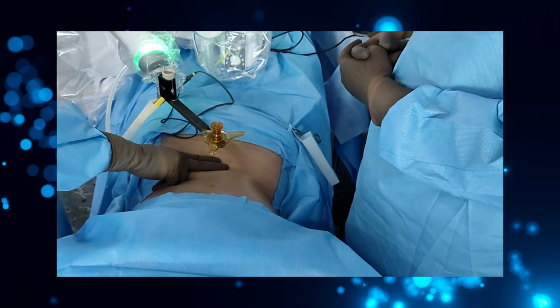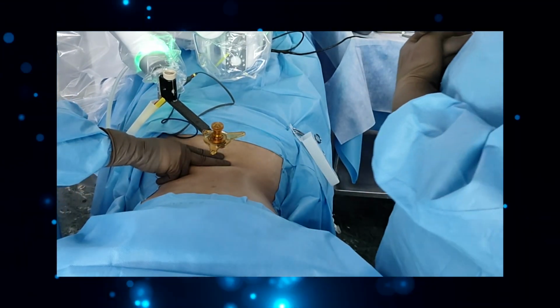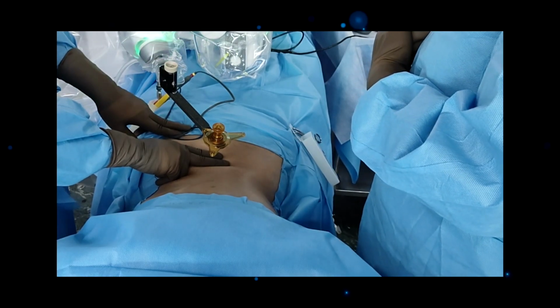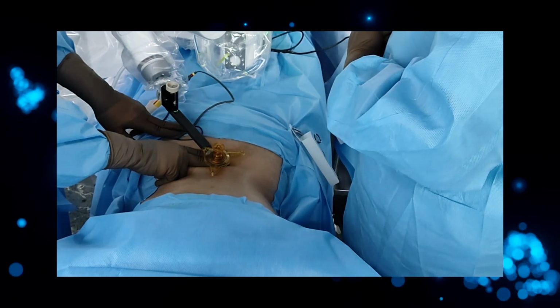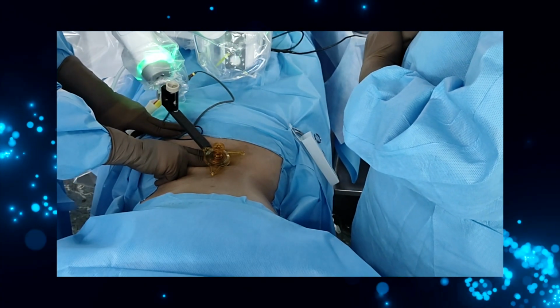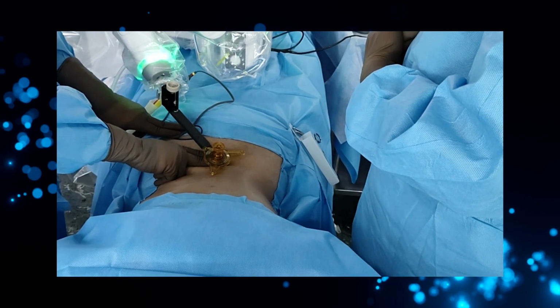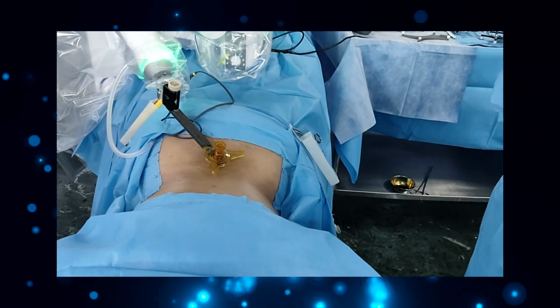The star marker is carefully brought as close to the patient's bony anatomy as possible without touching the body. This is crucial to prevent any back pressure on the marker or its extender, which could compromise accuracy. Placing the star marker closer to the bone allows for greater coverage of vertebral segments, as it can be positioned within the isocenter of the O-arm, maximizing the number of vertebrae captured in the scan.